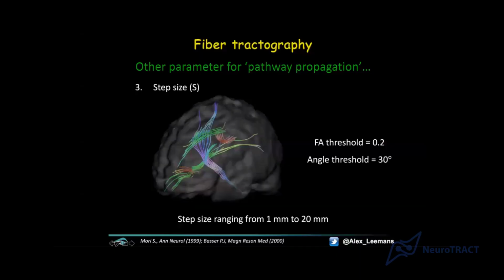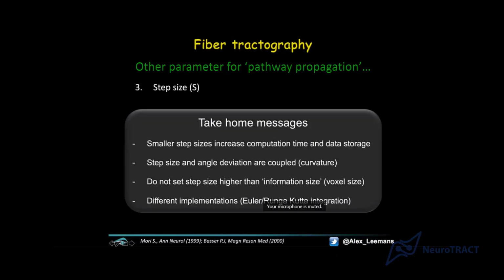Okay, so that's step size. And similarly, some take-home messages, things to be aware of. Like I said, if you take the step size too small, obviously your data storage and computation time increase linearly with the actual value.